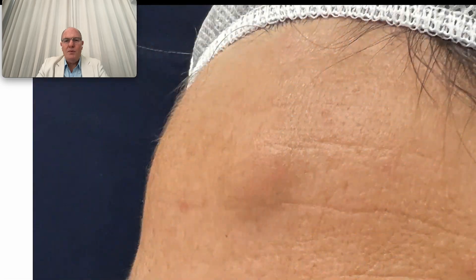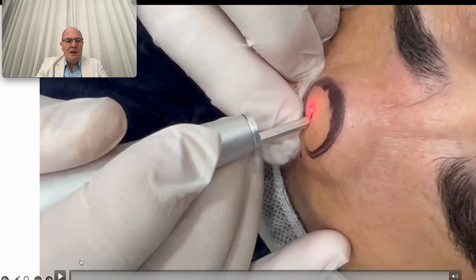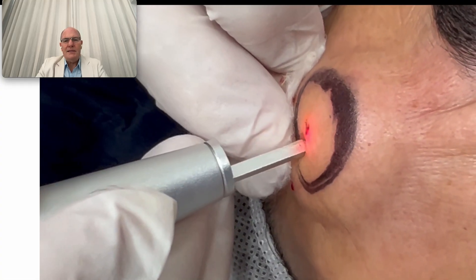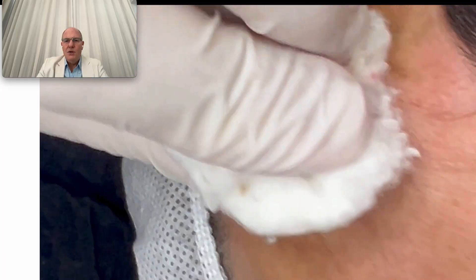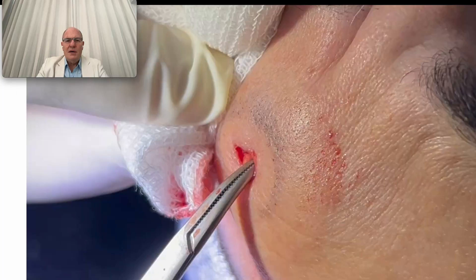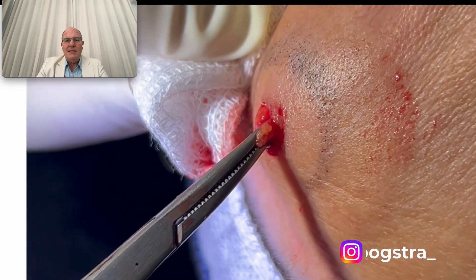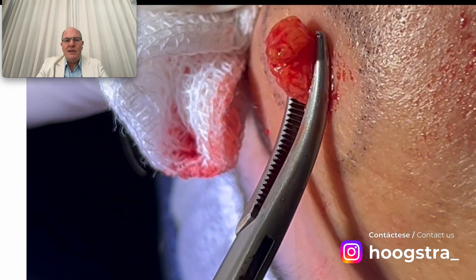Our proposal was to remove it through this minimal laser incision, like we can see here — a very, very small incision through which we began to decollate and undermine this area.